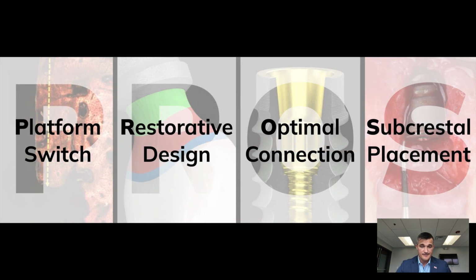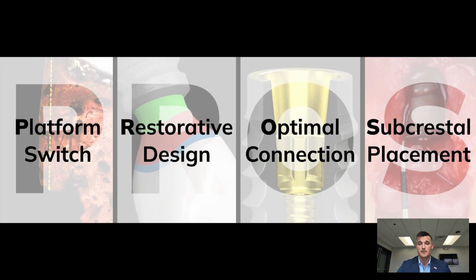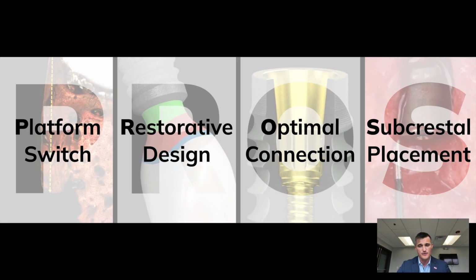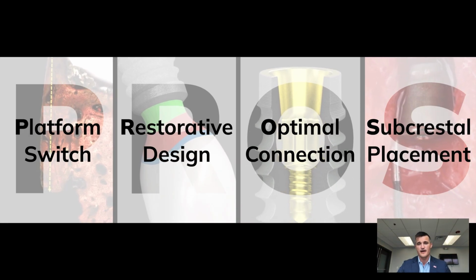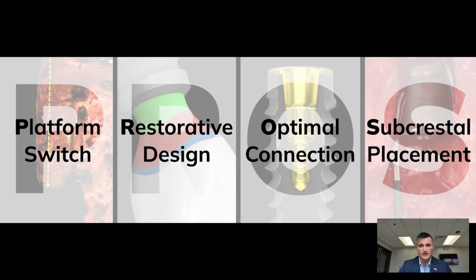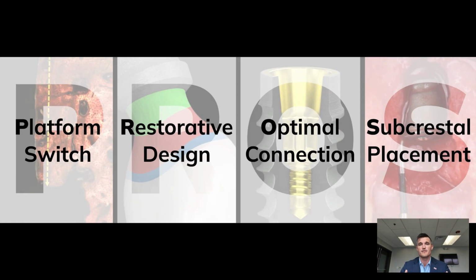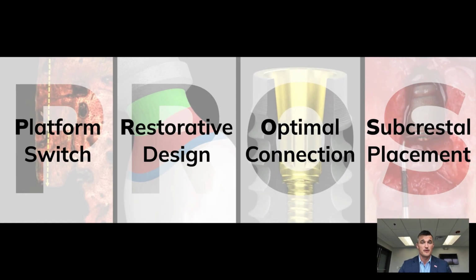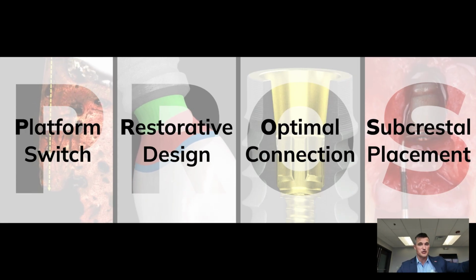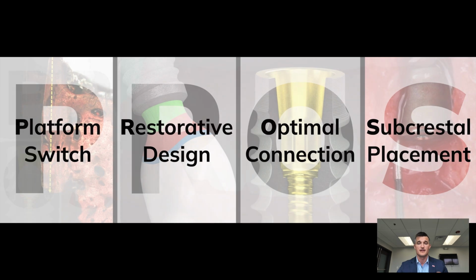And just to summarize, PROS concepts: platform switch, restorative design, optimal connection, and subcrestal placement. I recently had a case that I was recording for another webinar that I'm doing, and was able to record a surgery that really shows what it means to follow PROS concepts from the beginning. PROS concepts aren't something that I recommend following just with the final restoration. They should be followed from the time of the implant placement.